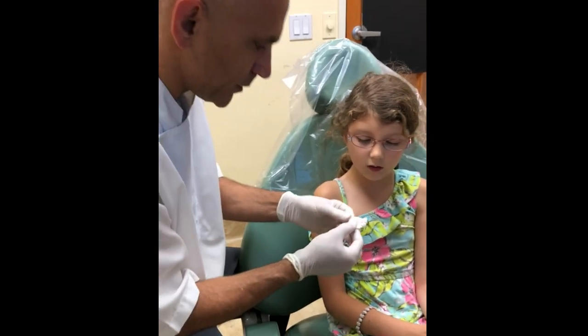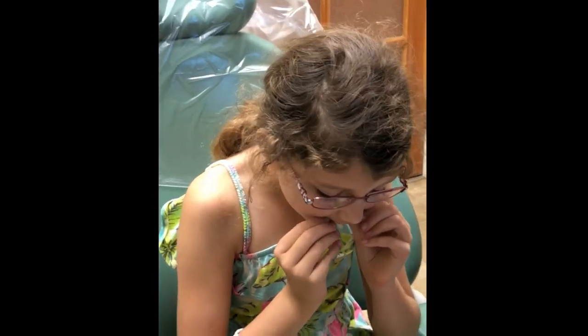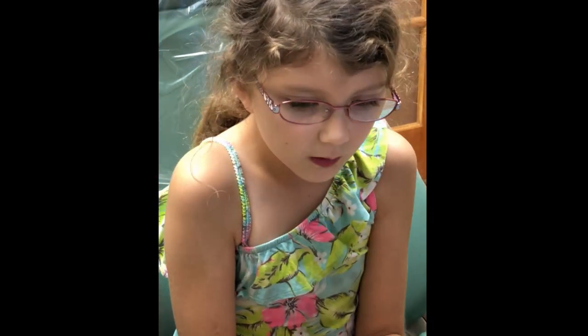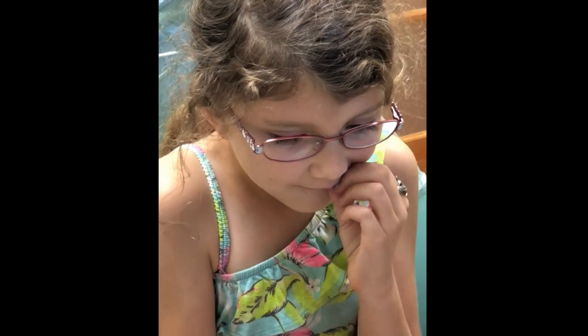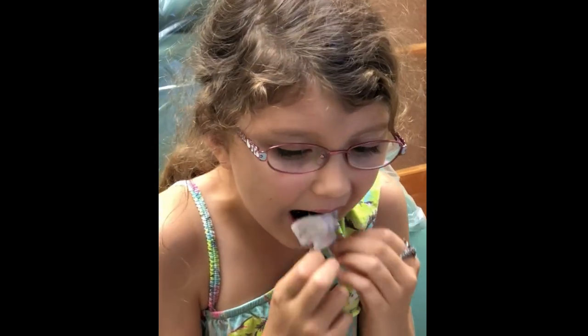Then you're gonna bend forward. Now try to put it back in and bite down on it. Is it in place? Okay, now take it off — a lot of pressure. Yeah, you got it.